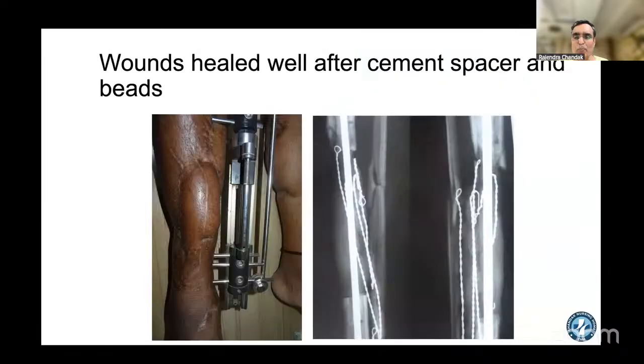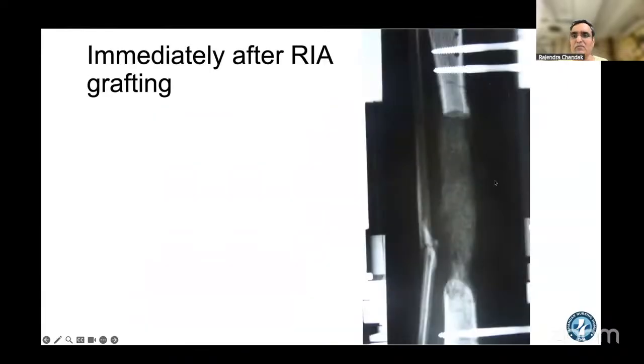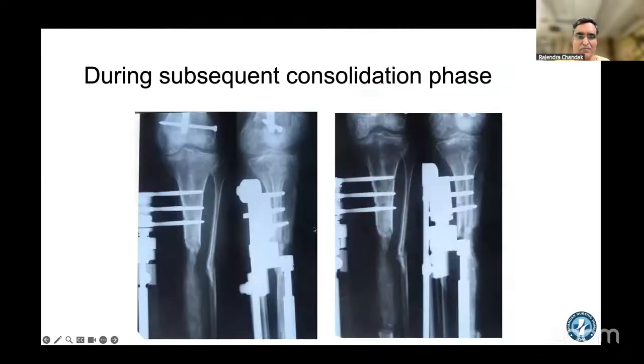Now, once you open that, you give an incision on that. So a masquelet membrane forms. And once the membrane forms in that patient, this is where the graft goes. You can put in fibula, you can split the fibula into four. That is an art, to split the fibula into four longitudinally. One of the fibula pieces you can insert in the tibia here and here. Here, of course, I have managed with a RIA graft. So these are the RIA grafts.